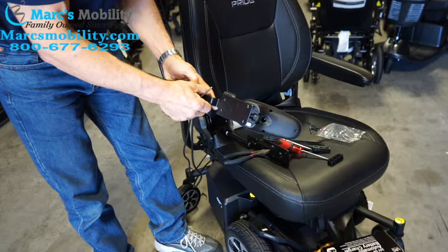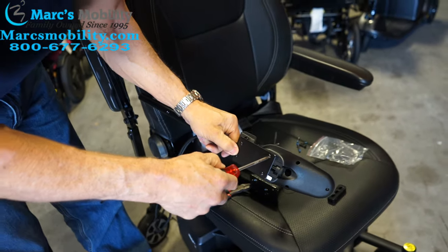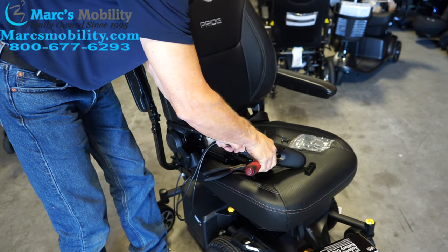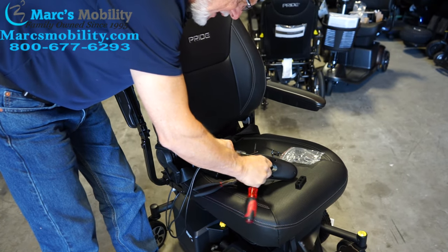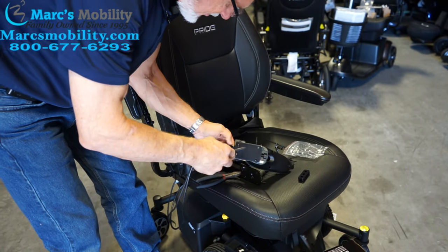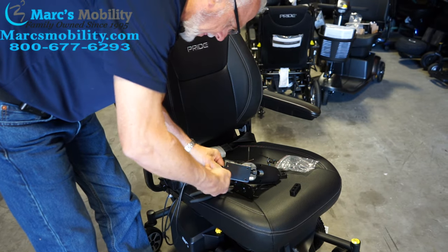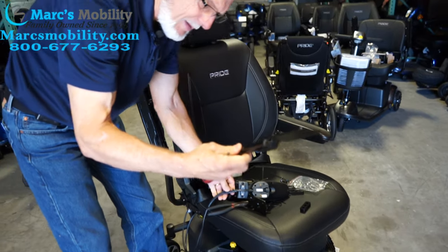Now you can see there are four screws here, under here. Take your Phillips screwdriver and remove these screws. The first two are for the joystick and the back two are for the light switch. Once you've removed those two screws for the light switch, you don't need that bracket — you can throw it away.